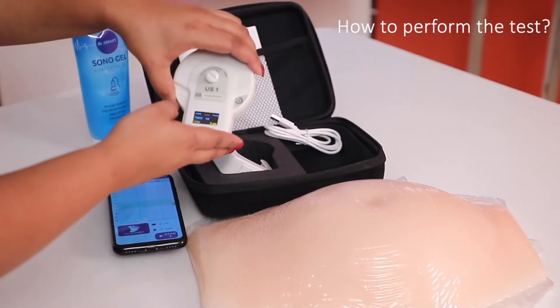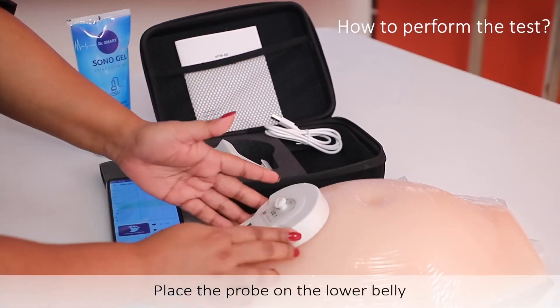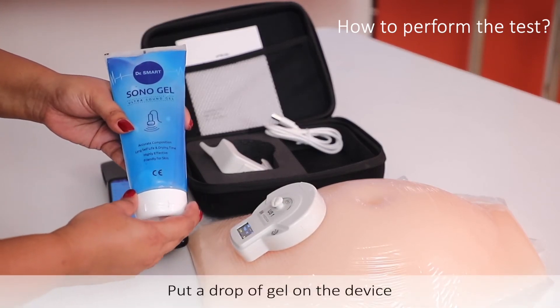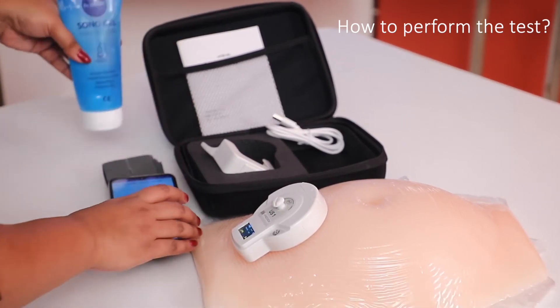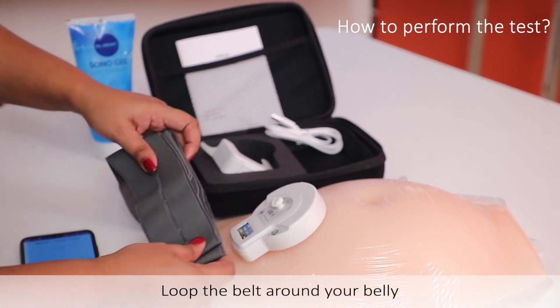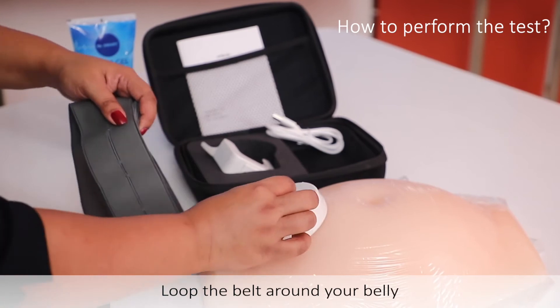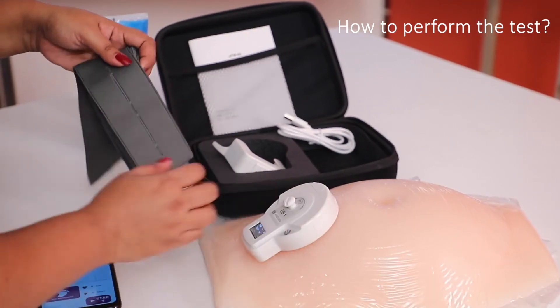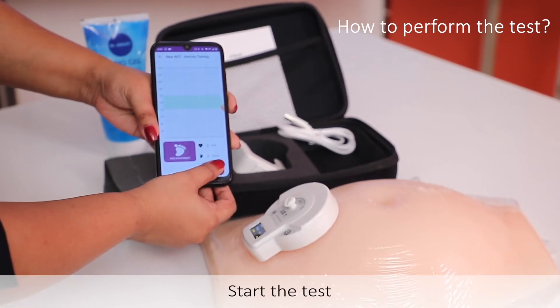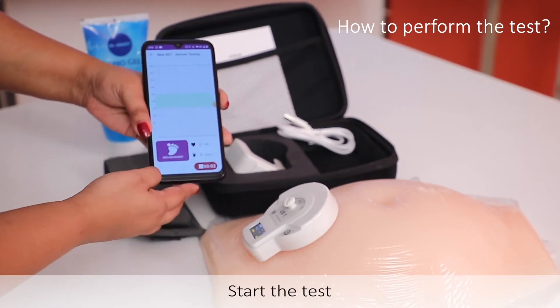You will have to take the probe and place it on your belly like this. Before that, you need to use the gel on it, else it will not sense the baby's heartbeat. After you have placed it, take the strap and loop it around your belly and hook it on with this hook. Over here is the start button — click on that and you will be able to do the test.